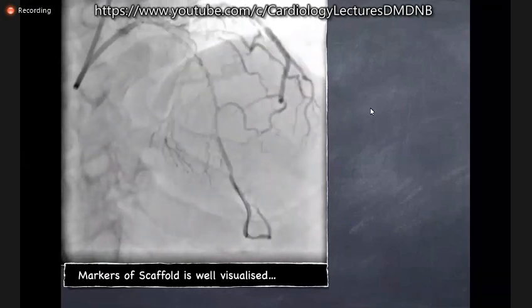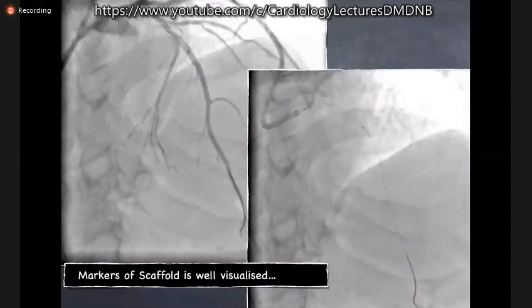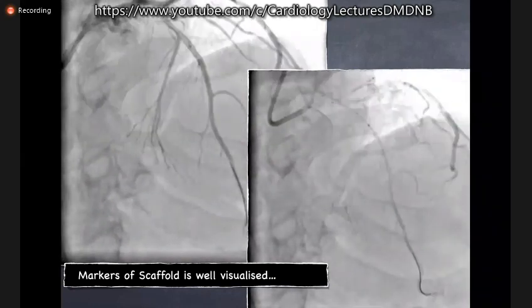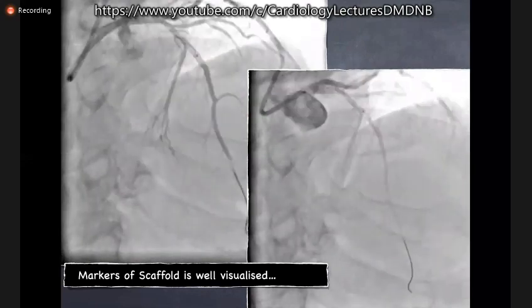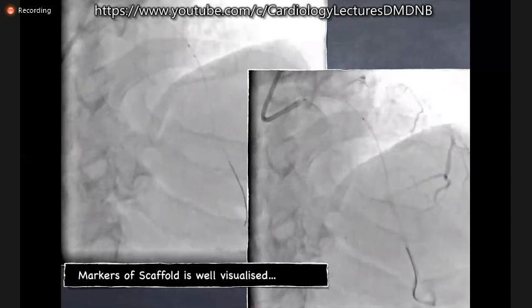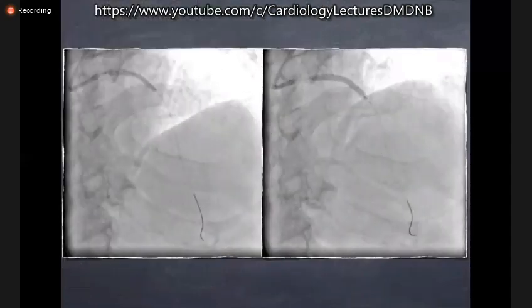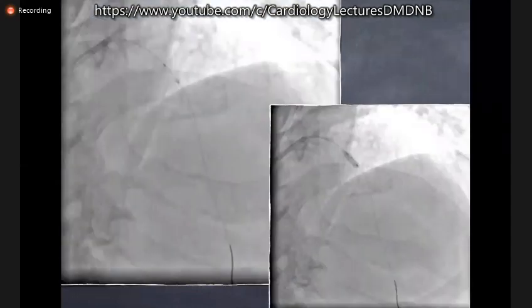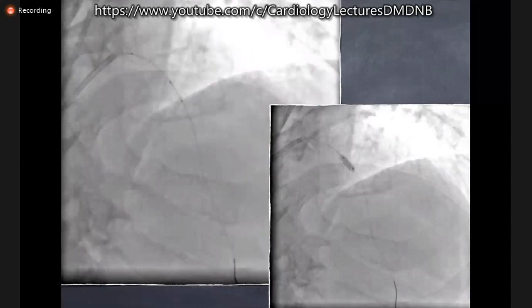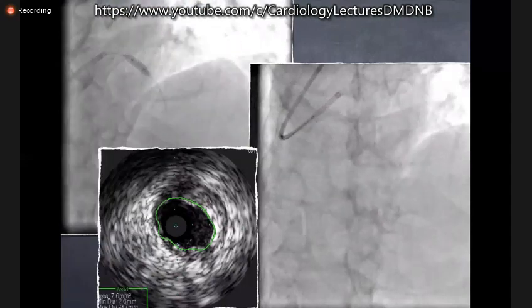So what I did was I tried to disengage the guide catheter and slowly pull back the balloon. I was very fortunate that when I slowly pulled back the balloon, the scaffold also came back, and it reached the area where I wanted to deploy the scaffold. I was very lucky. I deployed the scaffold there. That's the scaffold being deployed at 16 atmospheres, and then I took a new balloon because the distal end of the scaffold was not open well. So that was also properly deployed, and then further post-dilatation with a 3.5 millimeter balloon.